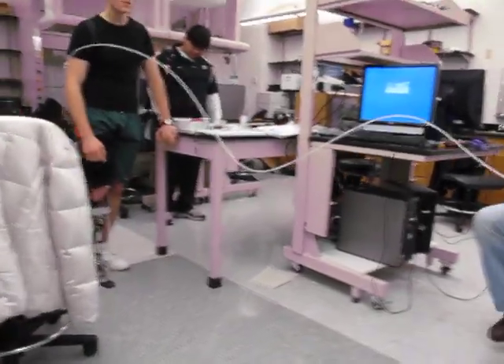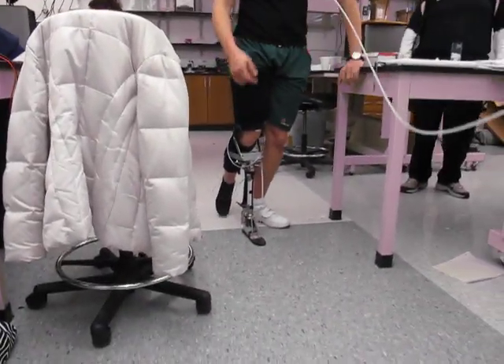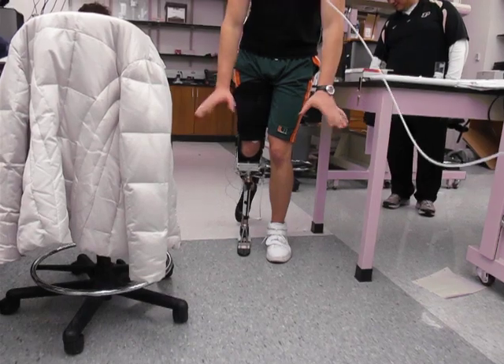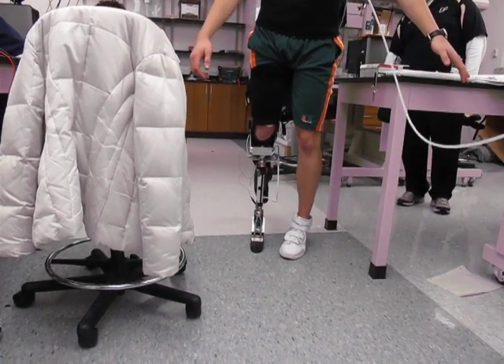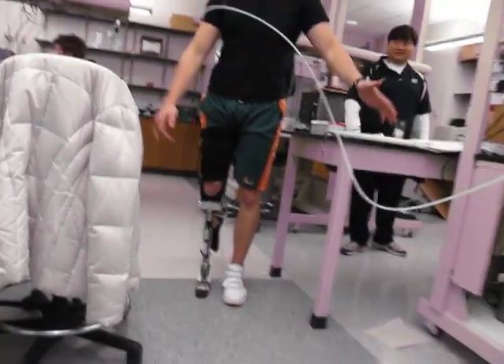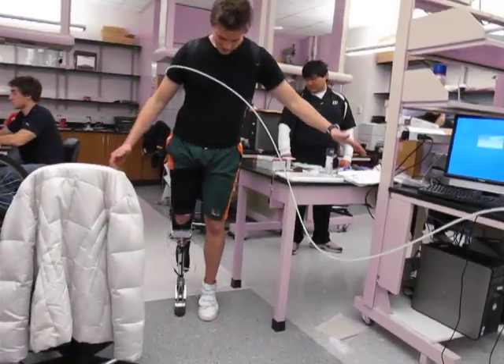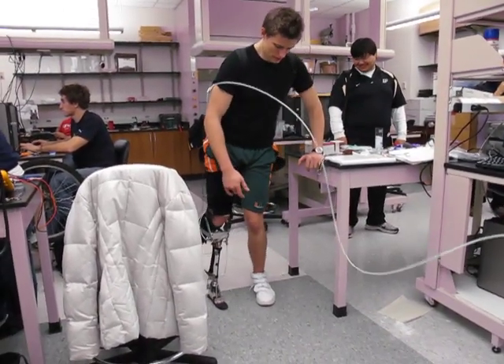Hold it up. Tiptoes. Yes. And it lets down immediately now. Alright, here we go — no hints. Eh, mediocre. I've seen better pneumatic actuated prosthetic limbs.